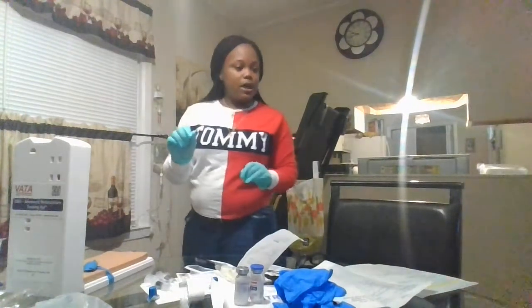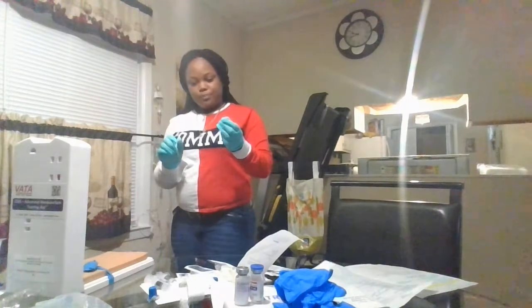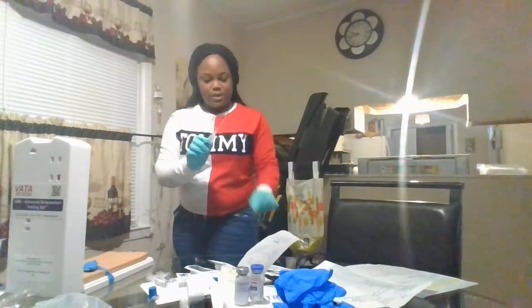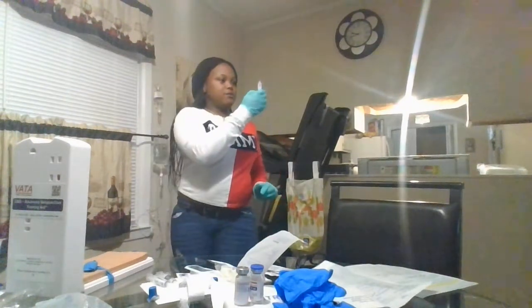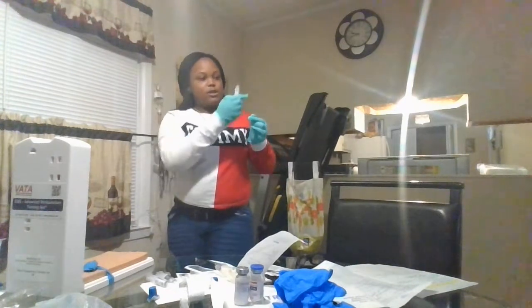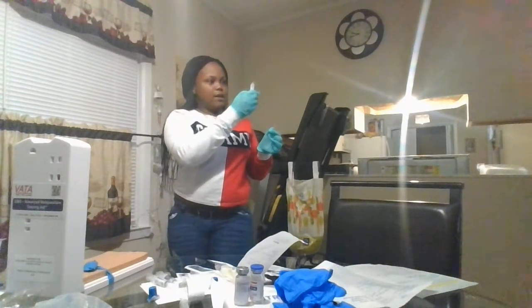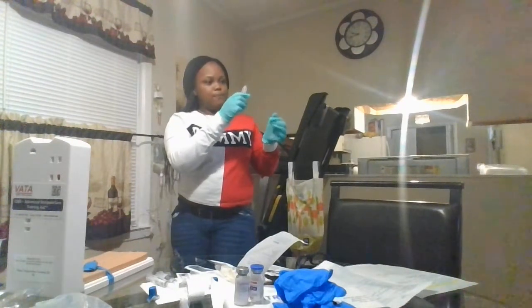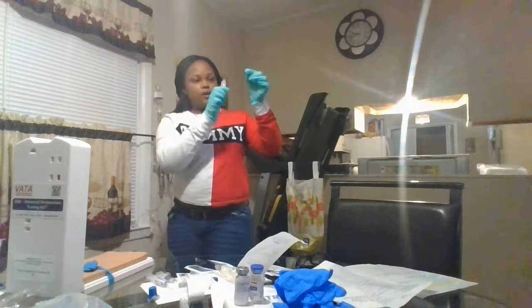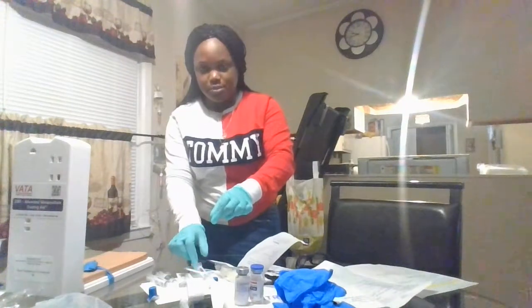My extension, I threw it away in my first video. So at this time, I'm going to connect my saline to my extension. Insert saline into the line and remove all the air out of my line. My cap is unscrewed on my extension. All right, and I'm going to screw that back on. I'm going to place those back into my pack so it can stay sterile.